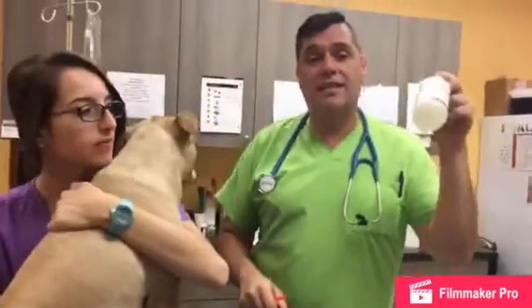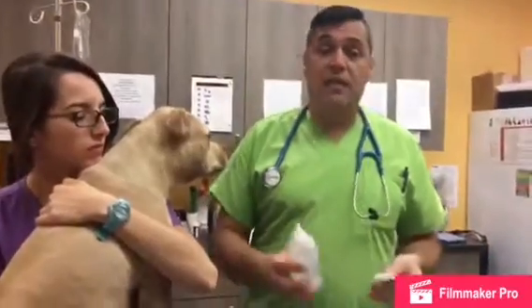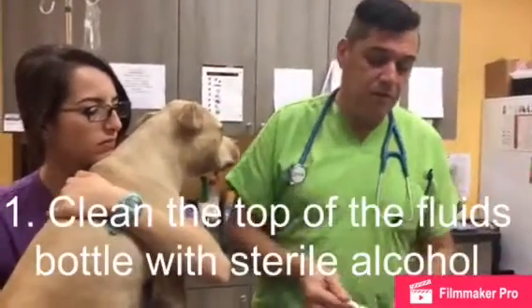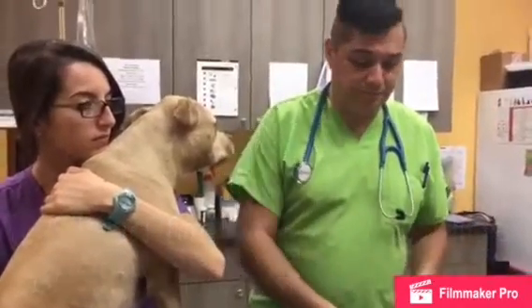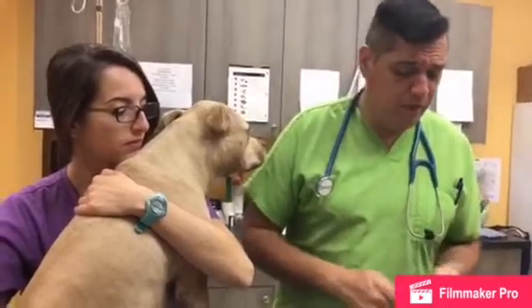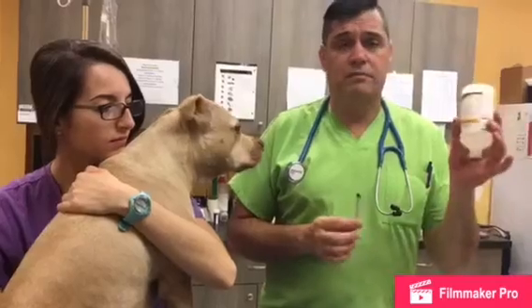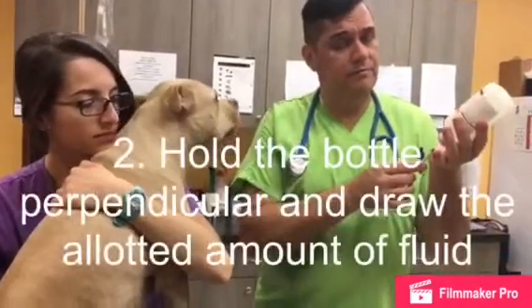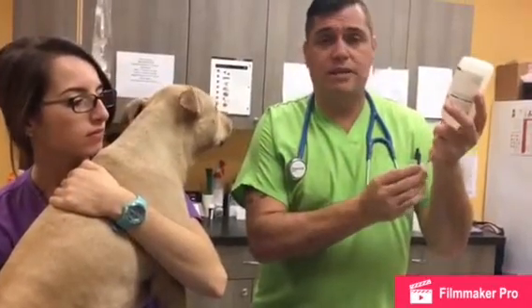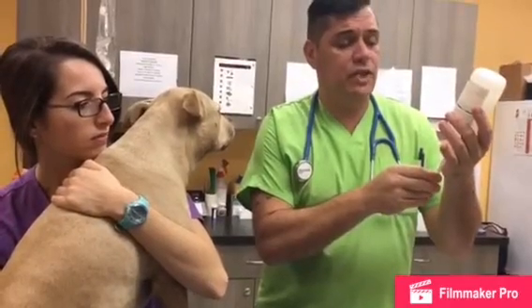Let's pretend this is our bottle of insulin — it's obviously just sterile water. Take a little alcohol, put it on a tissue, napkin, or paper towel, and just wipe the top of your bottle. Take our insulin syringe, hold the bottle perpendicular, and draw up the allotted amount prescribed by your veterinarian of insulin or any other type of injection.